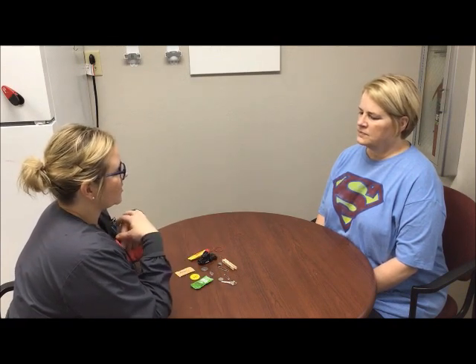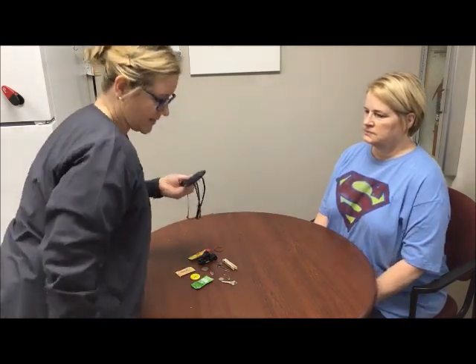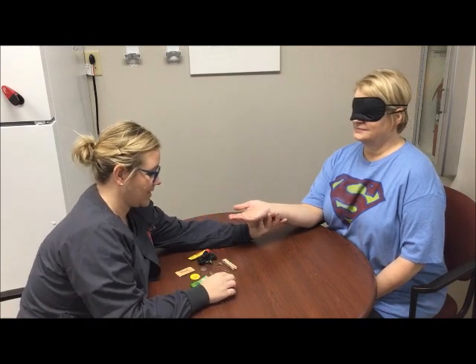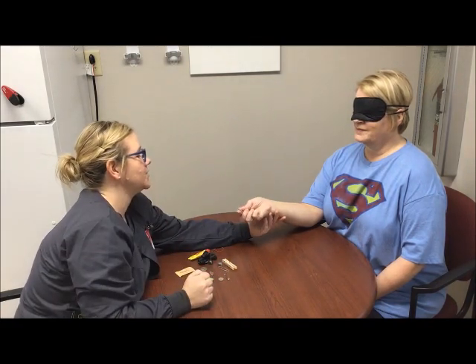What this test is — I'm going to put this over your eyes where you can't see, and have you hold your hand out, palm up. I'm going to place an item in your palm and you're going to feel it and manipulate it around, and then you're going to tell me what it is or what you think it is. Is there any item here that you don't recognize? I recognize all of them. Okay, I'm going to put this over your eyes. How's that? That's good. I'm going to place it in your palm — just move it around and tell me what you think it is.